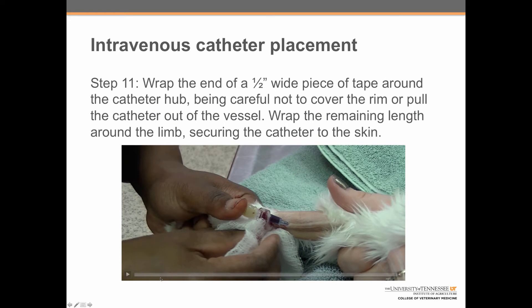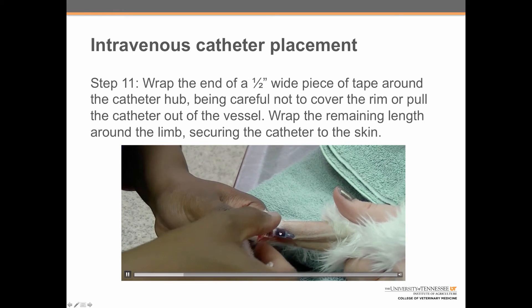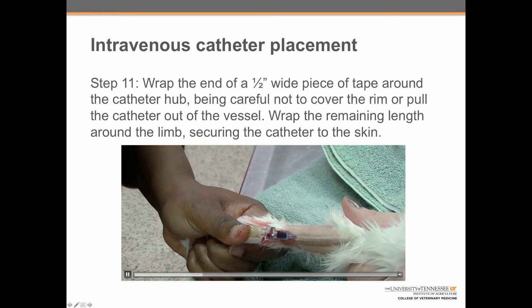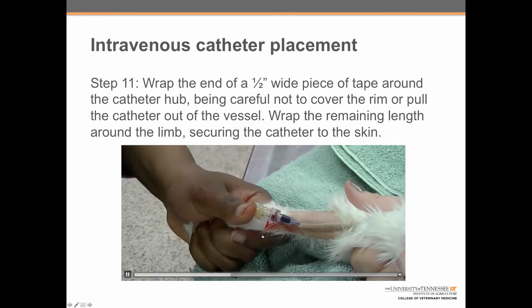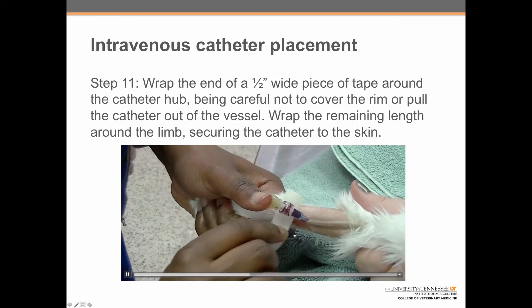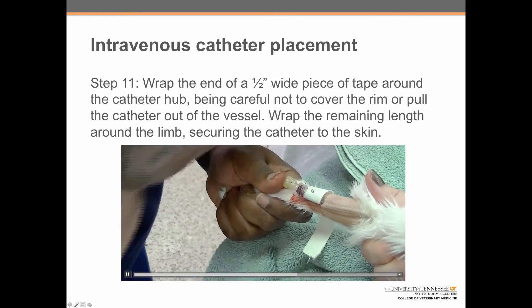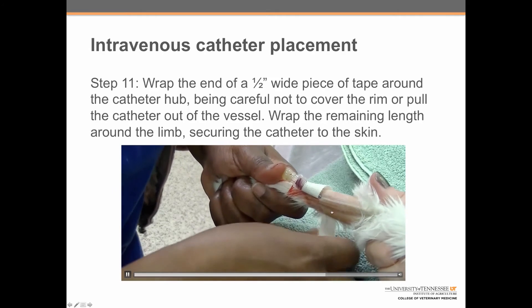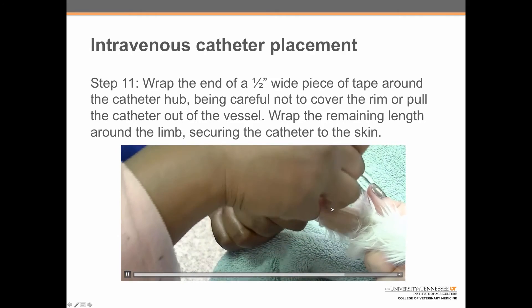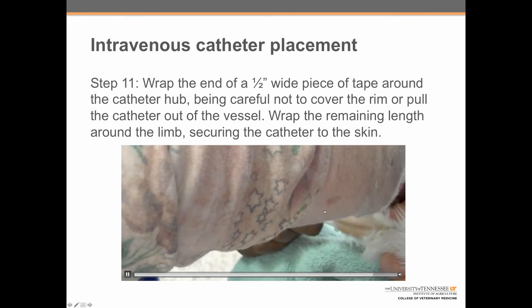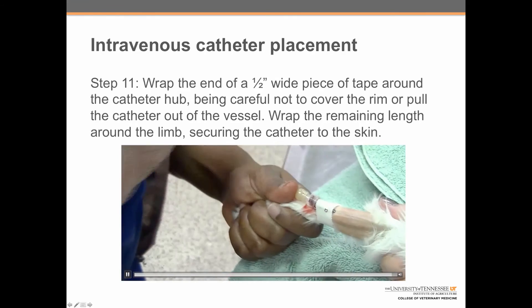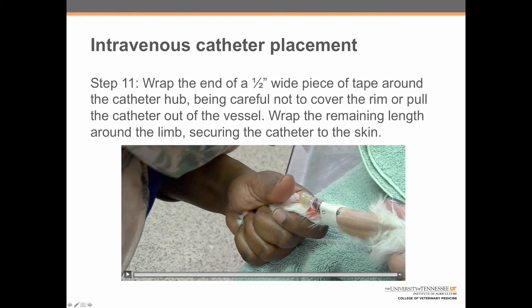Step 11: it's time to start securing the catheter. Wrap the end of one of the narrow half-inch pieces of tape around the catheter hub, sticky side up, being careful not to cover the rim and not to pull the catheter out of the vessel. She dries off any blood on the fur and continues wrapping the tape all the way around, then securing it onto itself to secure the catheter to the skin.